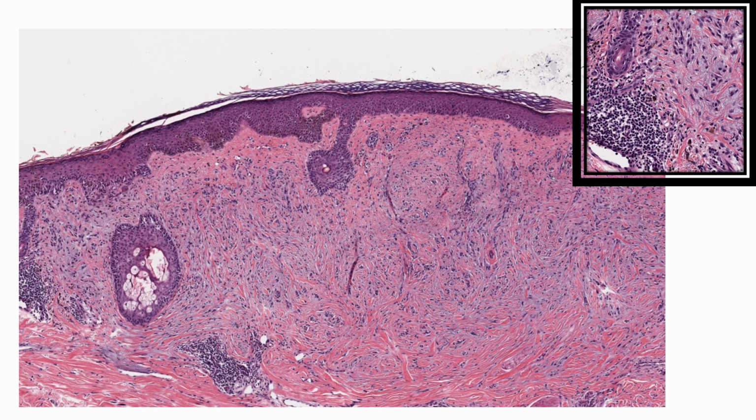So here is the histology. You can see in the dermis there is a proliferation of spindle cell neoplasm. Also, you can see there is a lymphoid aggregate. Pay attention: in the future of your practice, if you see a senior in a sun damaged area with lots of spindle cells and lymphocytic infiltrate, make sure it's not a melanoma. Again, melan A won't work here, only SOX10 will work. S100 works, but S100 is not very specific, so SOX10 is the choice.